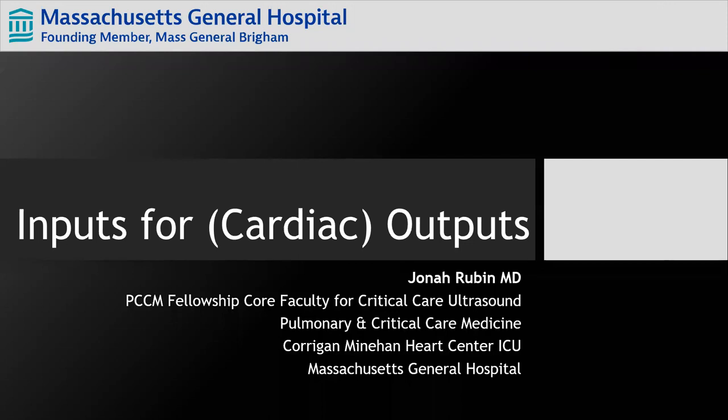Today we're talking about inputs for cardiac outputs. And I'd also like to welcome to our sessions the Anesthesia Critical Care Fellows and the Heart Center ICU APPs, and everyone should please feel comfortable speaking up and asking questions at any time.